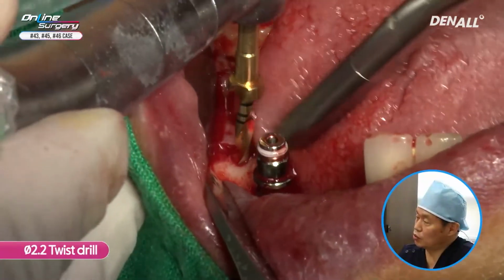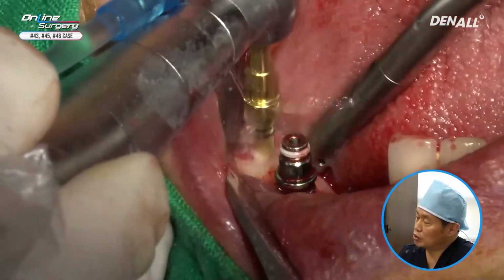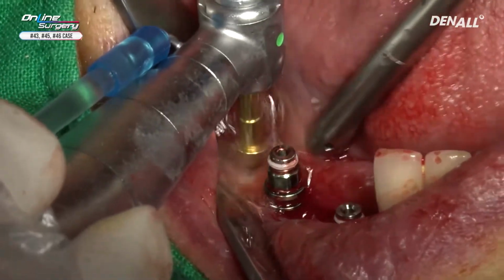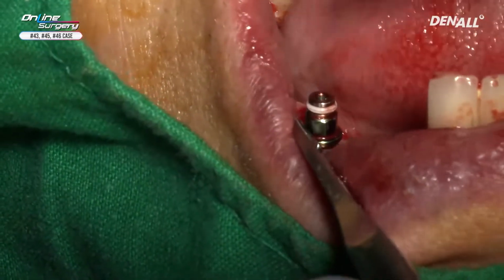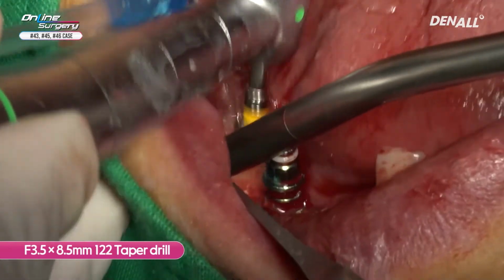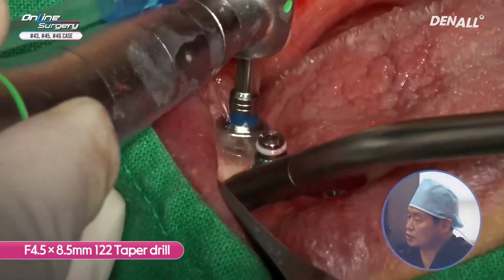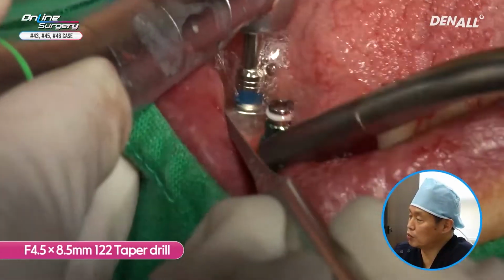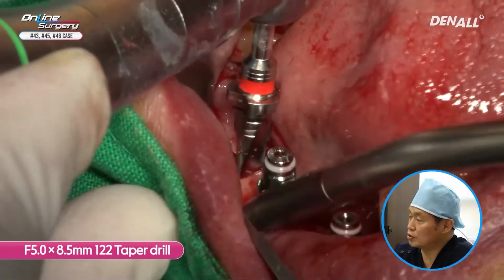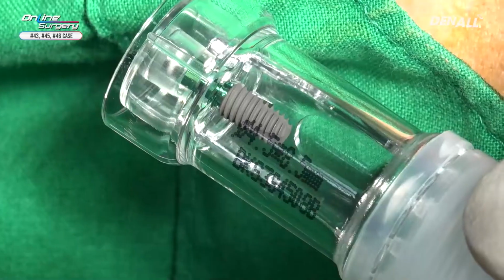Number 7, even if you don't place it, consider the relation with the antagonist and it is placed slightly distal to number 6. A 4.5 by 8.5 millimeter drill. The bone was quite hard, so a 5.0 by 8.5 taper drill is going to be used full length, and then placement is going to be done.